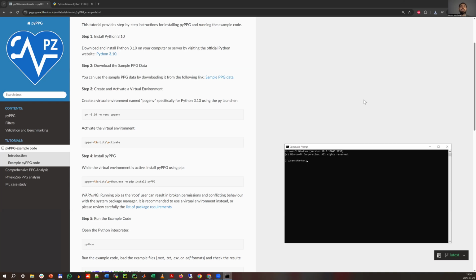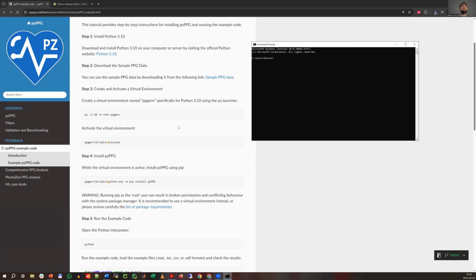And what we're gonna do is create a virtual environment. It's not necessary, but highly recommended to avoid package conflicts if you have other projects. When I start a new project, I just create a new virtual environment. It makes the project itself much clearer.